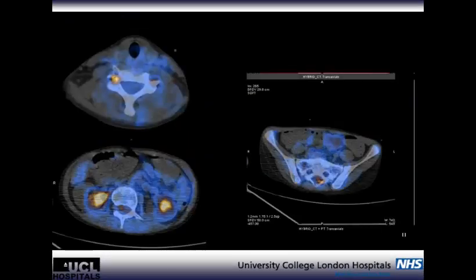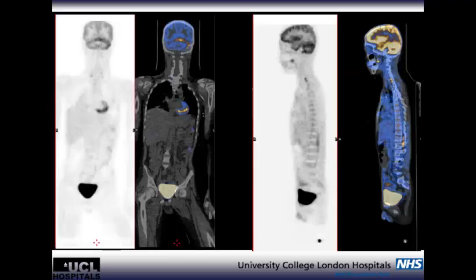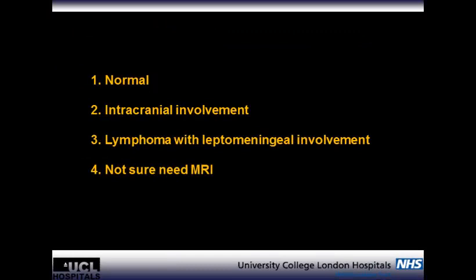So if I go back, you see that's intraspinal involvement. These are the exiting nerve roots which were involved, these are the sacral nerve roots, that's meningeal enhancement. These are the two points where those exiting nerve roots were, and those are intraspinal. Although there wasn't any splenomegaly or nodal disease.